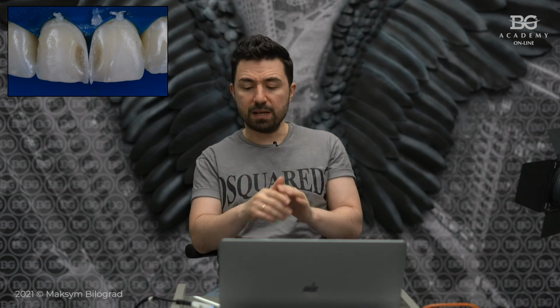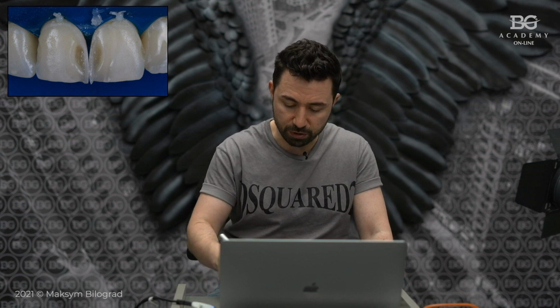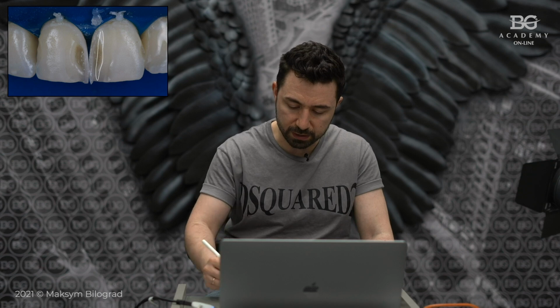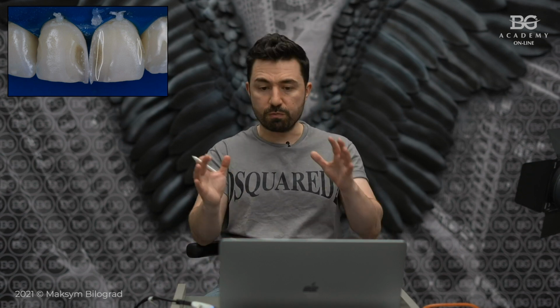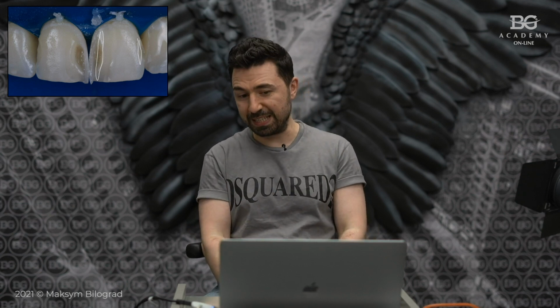But you can play with layering, with the vertical layering on tooth number 21. For example, if I start doing more vertical components of my layering, and then I go for the finishing and polishing procedure properly, playing with highlights, I can optically make this tooth slimmer than it is.